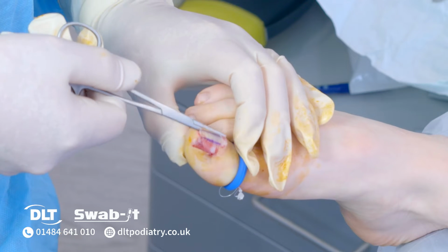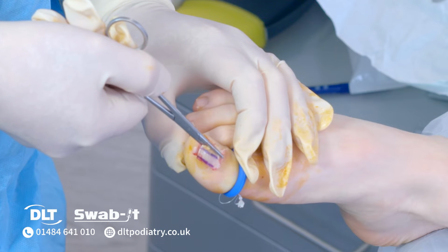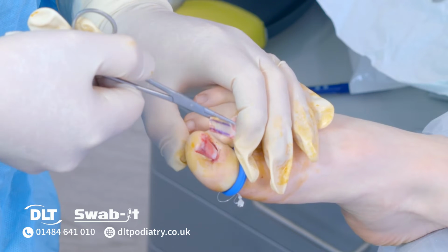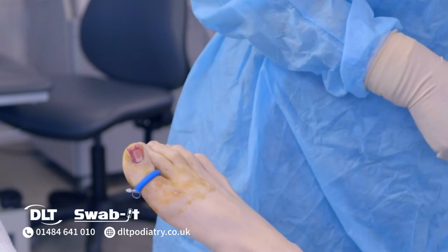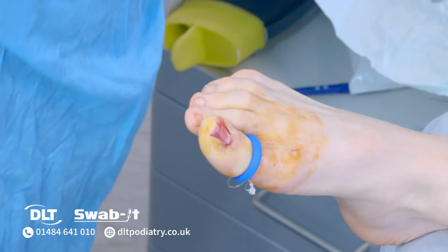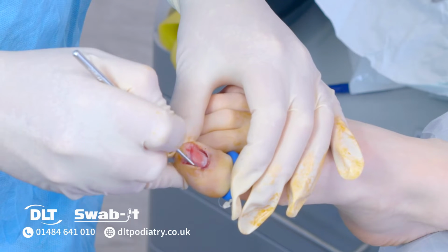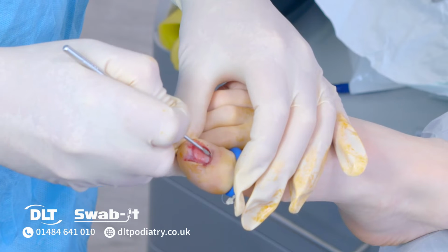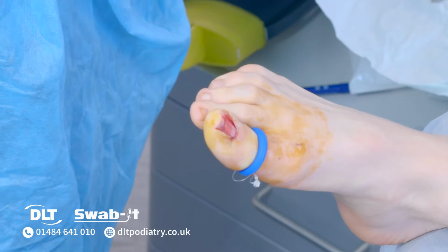If we hadn't done the previous wedge resection, you can rotate to the middle, and then you go down the other side and rotate to the middle. Some people prefer just to split the nail in half. And you can see the nail comes out completely fully. If you're in doubt at all, you can check with the back end of a Black's file for any resistance, and it looks particularly fully clear.